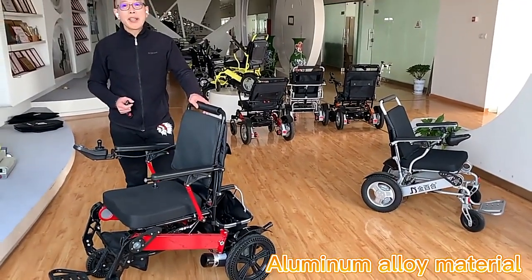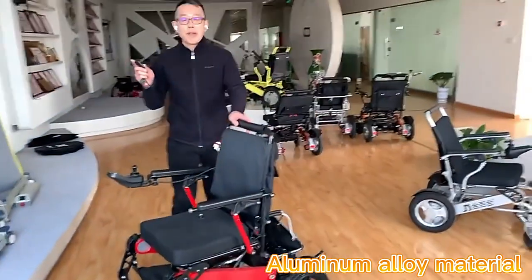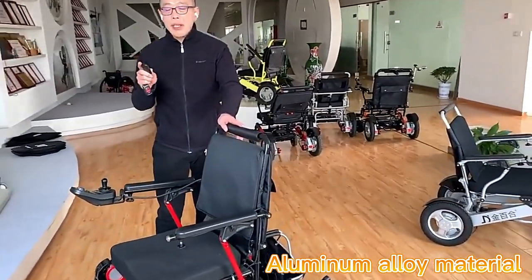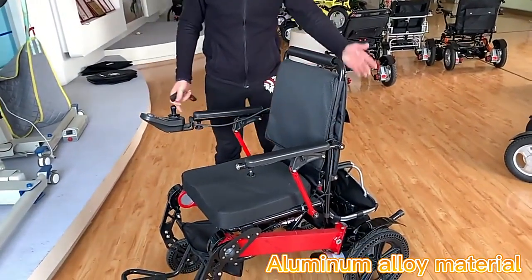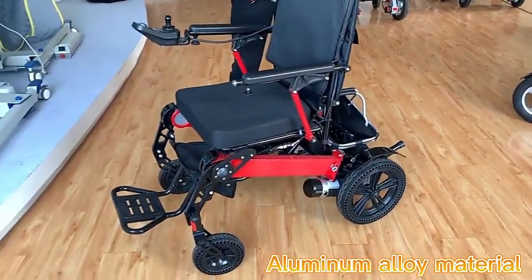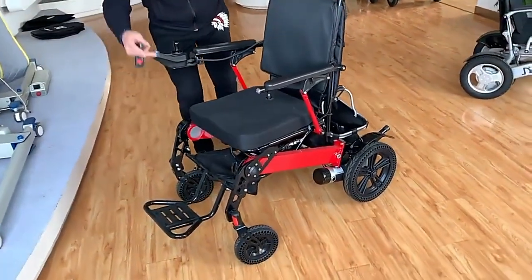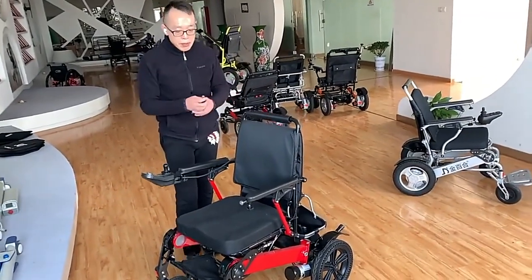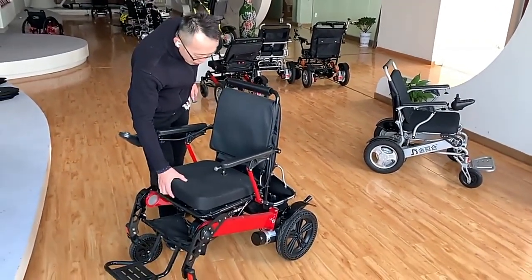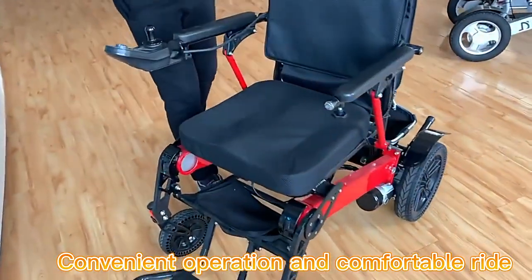This is a new model D19, which is a remote controlled folding and unfolding wheelchair. This model features a dynamic controller and also a brushed motor with larger dimensions, larger seat heights that allow taller people to sit on it with more comfort, with the ergonomic memory foam cushion.